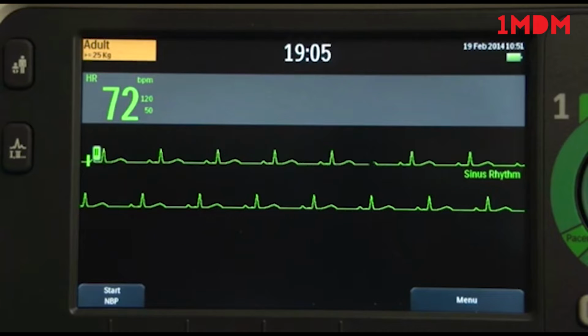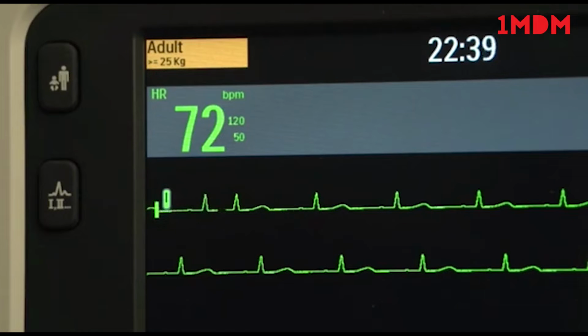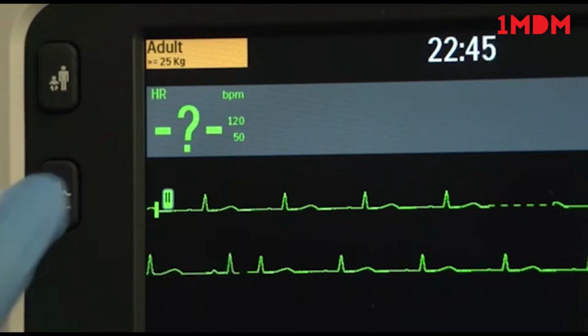You can also change the waveform for each sector during a patient event. How to change a waveform differs depending if you are in AED mode or not. In non-AED mode, the ECG wave for wave sector 1 is selected through the Lead Select button or through the displayed Waves menu.